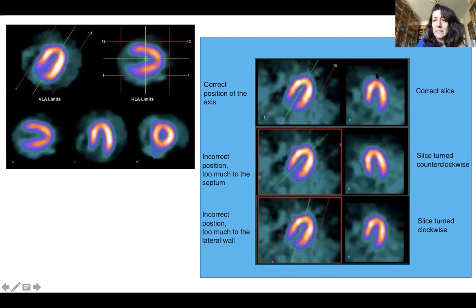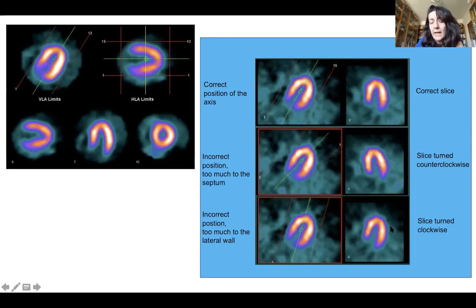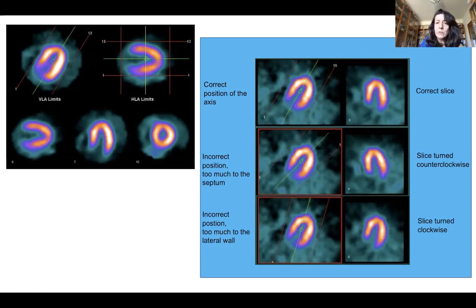This is the correct position of the axis giving you the correct slices. An incorrect position — too much toward the septum — causes the slices to rotate counterclockwise. Likewise, a position too close to the lateral wall causes the slices to rotate clockwise. You need to be sure the axis is very well aligned.